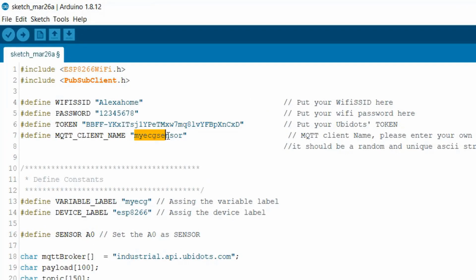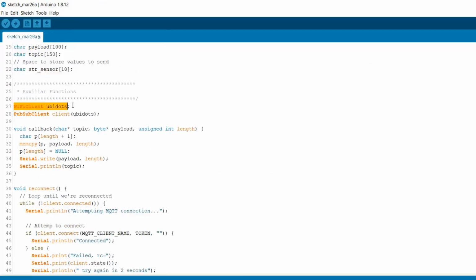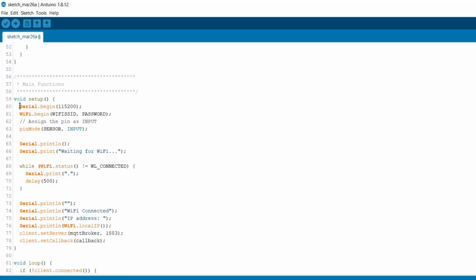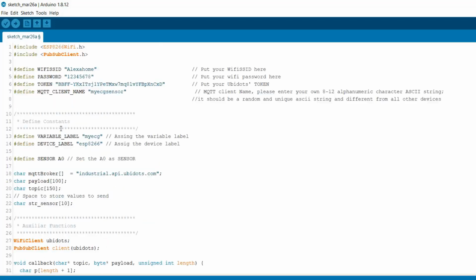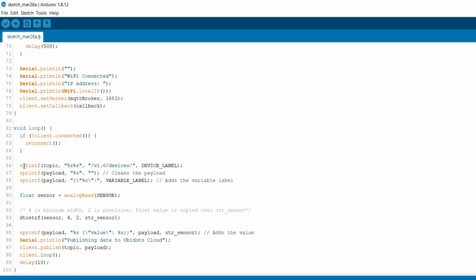Under the MQTT client name, you can write any name, whatever you like. There is a variable label and device label. These two are the only important parameters that will be displayed using the MQTT connection. The rest of the code is similar to earlier. You can just go through the code and understand that the MQTT protocol is used for sending the data over the internet. We have also used the PubSubClient for that. Okay, so that's all from the code section. If you are facing a problem in understanding the code, you can comment in the comment section below.